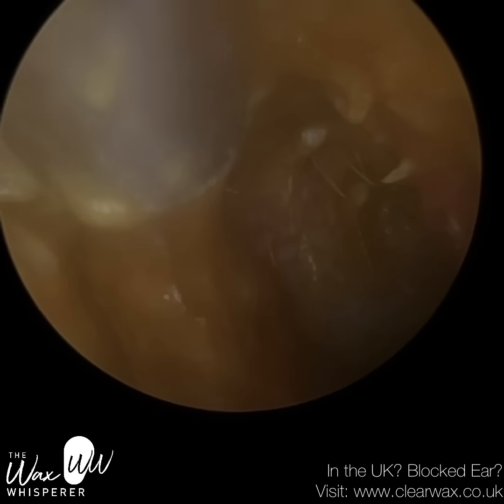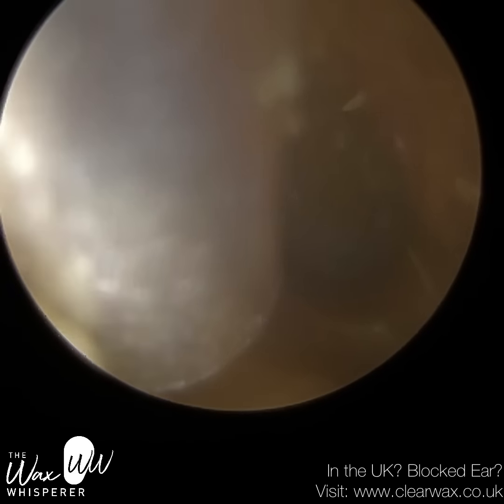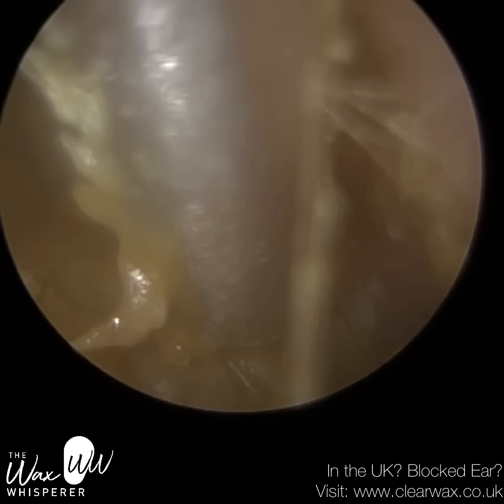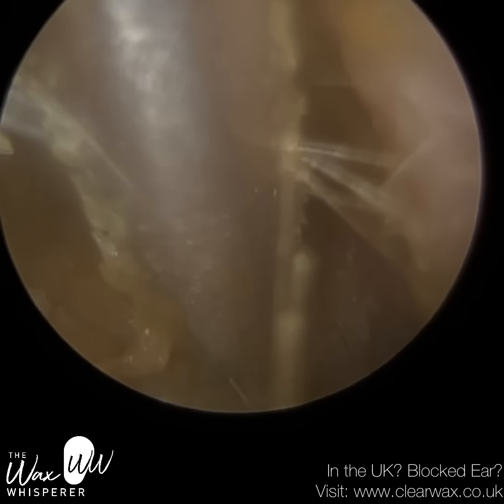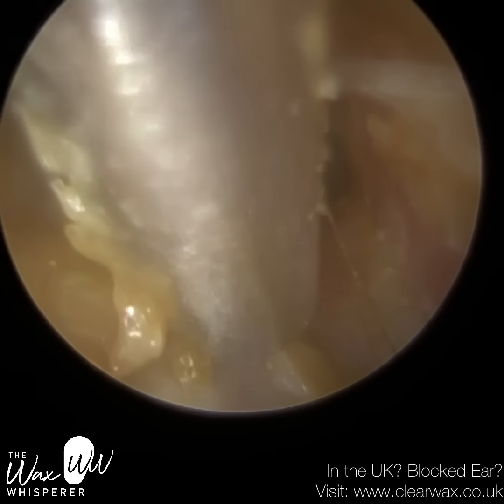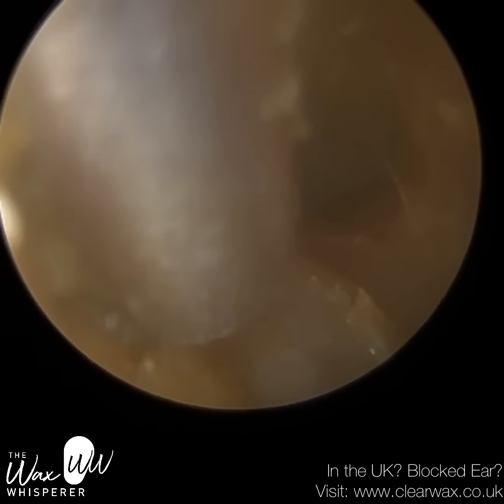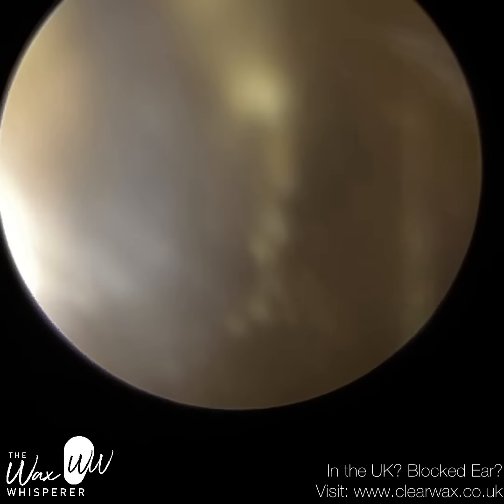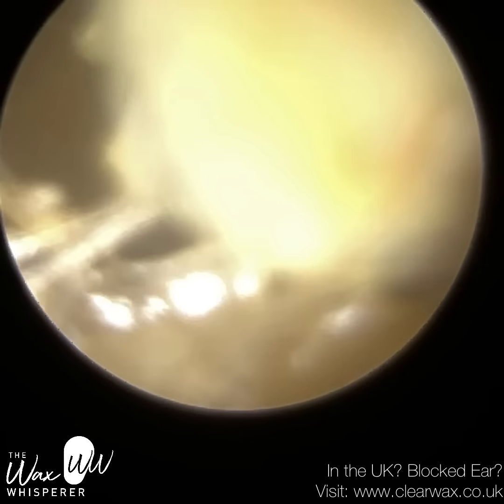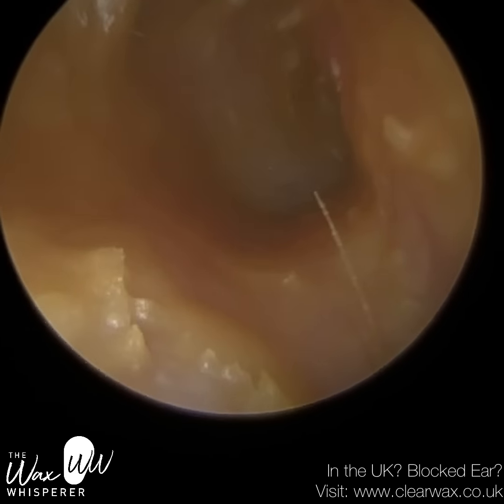That can work to our advantage because when you've got a bit of edema, swelling, it gives it a little bit of a buffer. The inner two-thirds of the ear canal is a very sensitive part of the ear canal. It's a thin layer of skin, less than 0.1 millimeters in thickness, that lines directly on the bone, the temporal bone. If you make contact with that, it can be very sensitive for the patient, as I alluded to earlier with the anterior canal wall. When you've got a bit of swelling in the ear canal, it provides a bit of a cushion. So we can sometimes use that to our advantage, but not always.